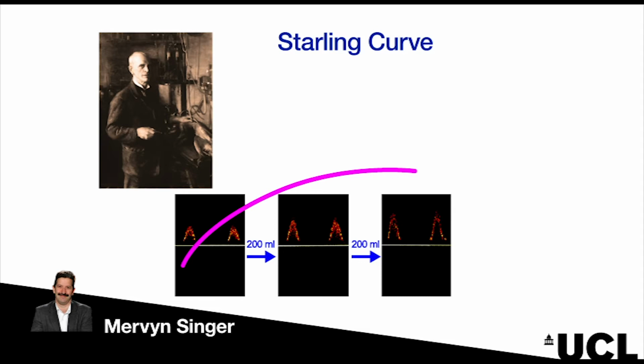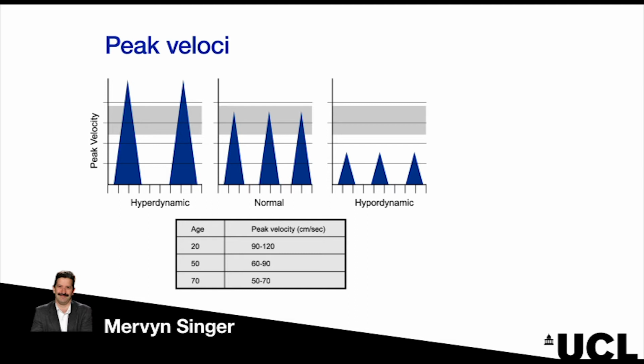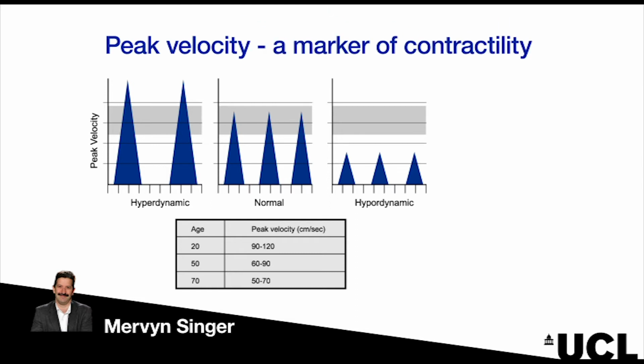I mentioned earlier that the peak velocity is a marker of contractility. So as you get older, unfortunately, your heart doesn't contract as well. For every year of adult life, the performance of the heart decreases by about 1%. So the peak velocity, which in a 20-year-old patient is somewhere between 90 to 120 centimeters per second, will drop gradually with age. In a healthy 50-year-old, it will be about 60 to 90 centimeters per second. In a 70-year-old, it will be about 50 to 70. So these are normal ranges.